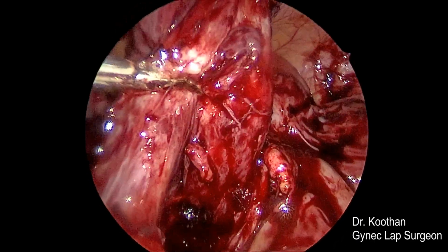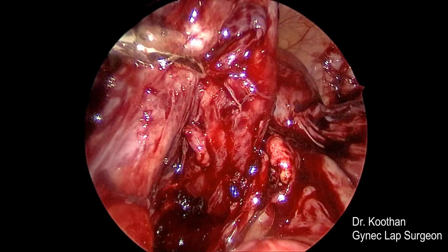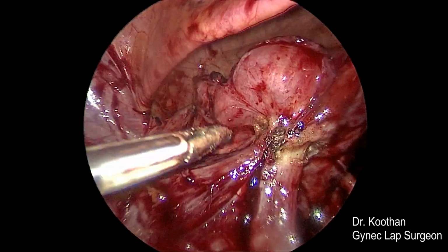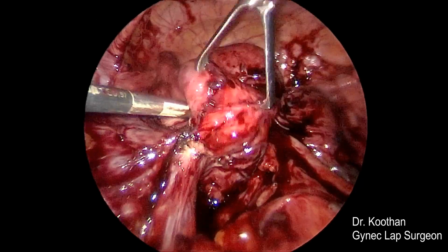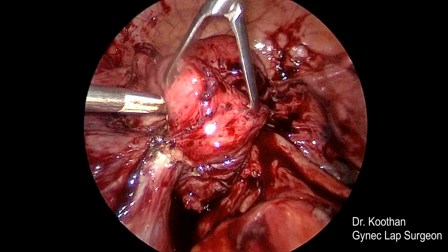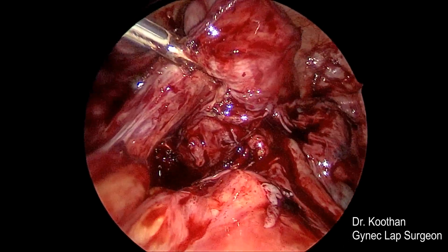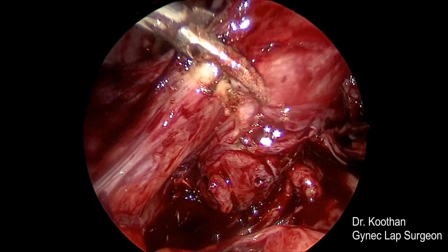So now proceeding with left side total salpingectomy. The adhesiolysis in and around the Pyosalpinx has been done. Now proceeding with the salpingectomy.